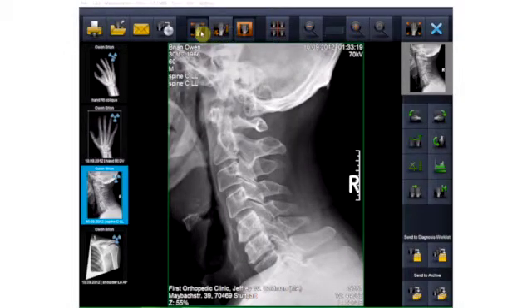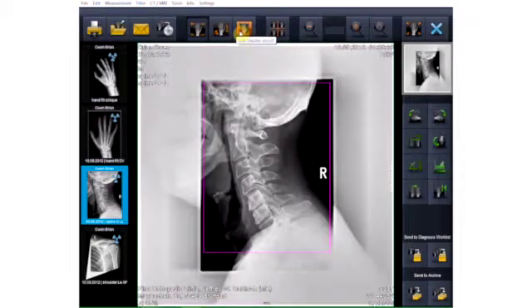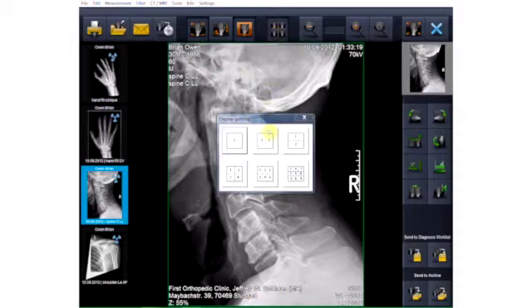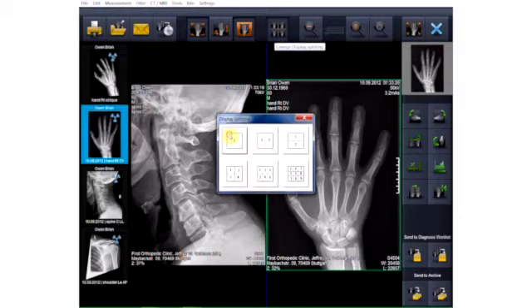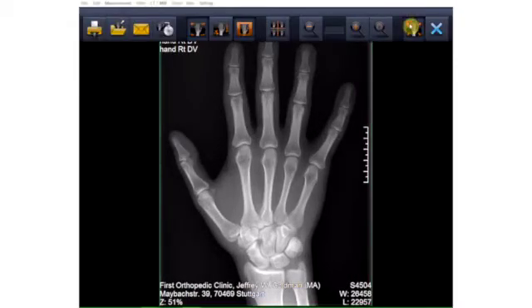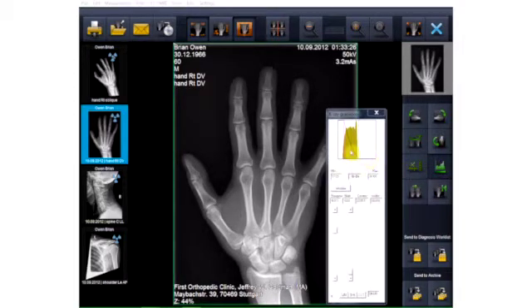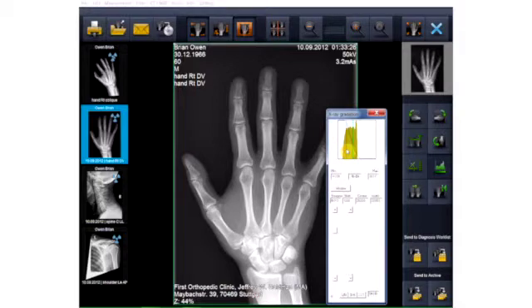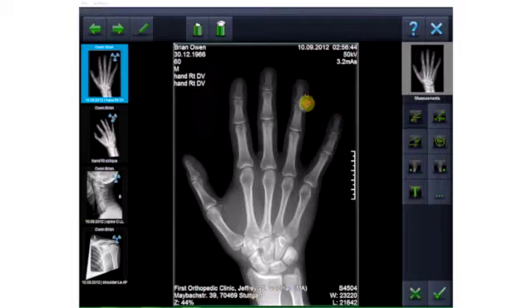In addition to the tools available in the overview screen, viewer mode offers you the following functions: turn data overlay on or off, take measurements, or activate and deactivate the shutter. You can change the display splitting, zoom images in and out, turn on full screen mode, and rotate and mirror images. If the images appear too dark or light, you can use the gradation tool to optimize them. Thanks to the available measurement functions, you can set angles, measure distance and outline, set x-ray markers, and add brief comments.